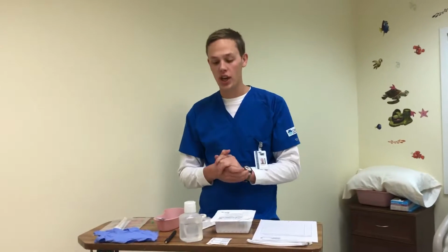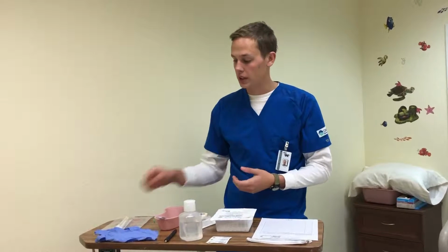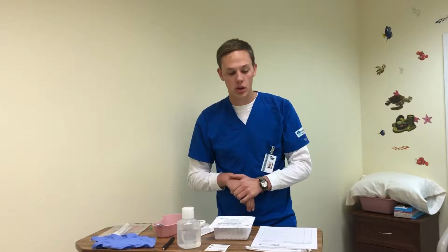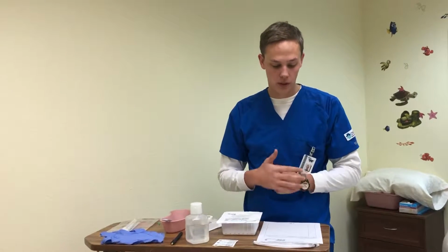I'm a student nurse at Wilson State College, and today I'm going to be performing a skill video of a dressing change, cleaning the wound, as well as collecting a culture for the wound, and then rebandaging that wound. So the first thing I'm going to do is check my provider order.